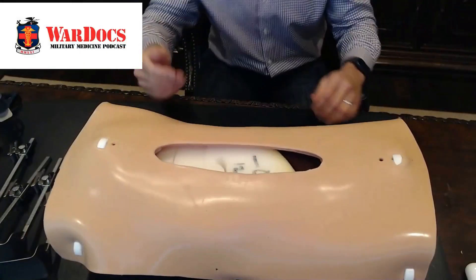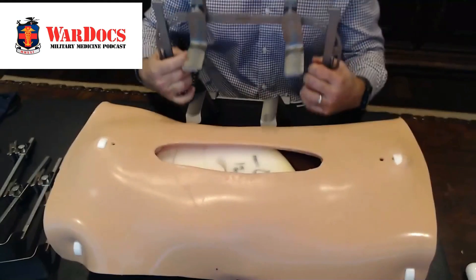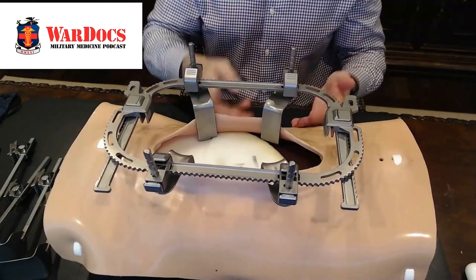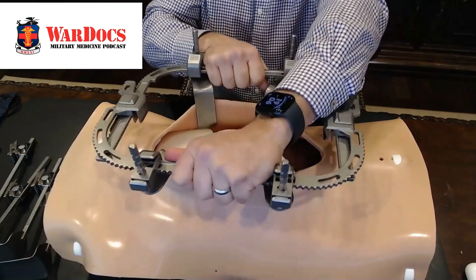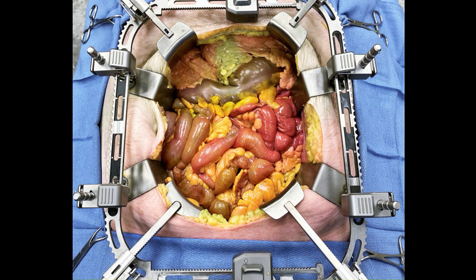So I have a demo here of the abdominal surgical model that we use for training. Imagine this being your standard laparotomy incision. You make your incision, this gets assembled by your tech, and essentially you just insert this. Now you clear your bowel from underneath your blades — these are your bowel retractor blades — and now your four points of contact. One person on one side, and you basically just ratchet it out.